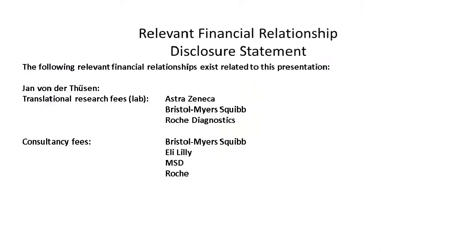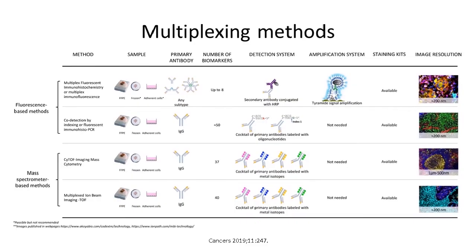So as has been introduced, I'm a thoracic pathologist in Rotterdam. So I deal with both oncological thoracic pathology and non-oncological thoracic pathology. And I think both would actually, to some extent, already benefit from the introduction of multiplex immunohistochemistry and immunofluorescence in clinical practice and routine diagnosis.